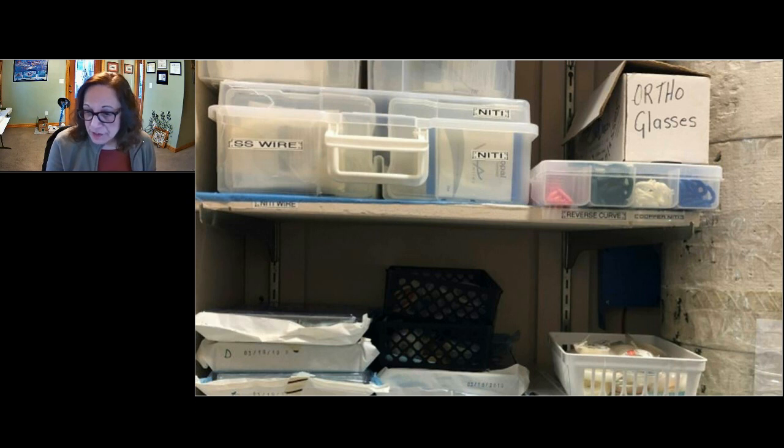There's several things wrong with this picture, but we'll talk first about the biggest thing jumping out at you. This is piping for a ventilation system, wrapped the way they have to wrap that stuff. But this is a filthy, dirty item next to where sterile instruments are stored. And of course, one of the principles of sterile instrument storage is they should be stored in a clean environment. This is anything but that, what you see on your slide.